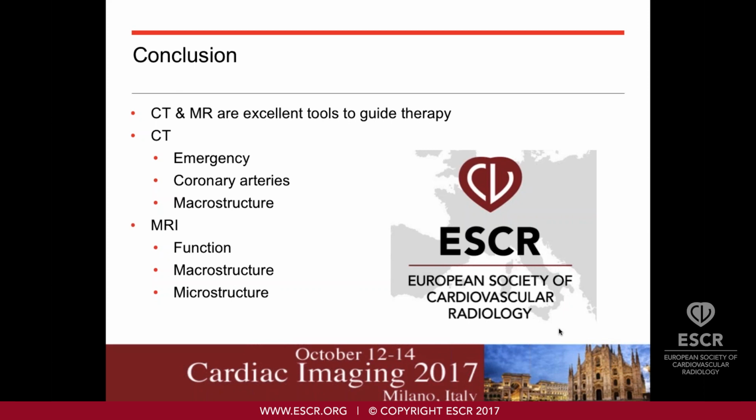However, we really appreciate the opportunity to use a spectral CT in patients where for some reason MR is not possible. However, our experience is that MR is the more powerful tool. So whenever there's a possibility to do MR, MR would be the better way to go to characterize the myocardium. So CT is rather reserved for cases where we cannot use MR for any reason.